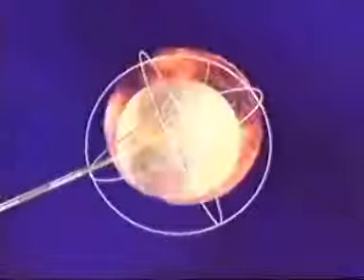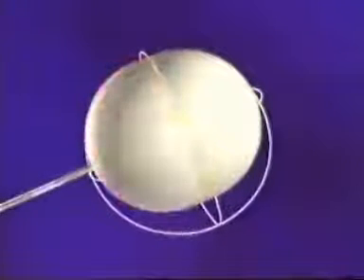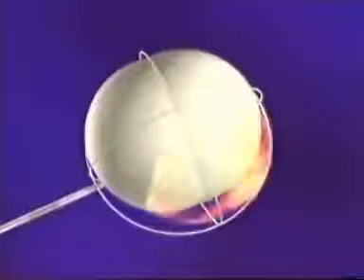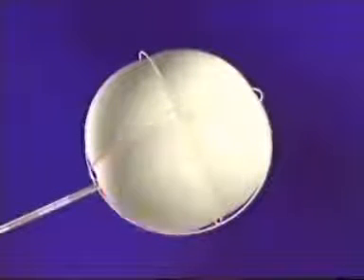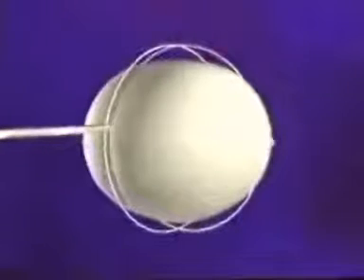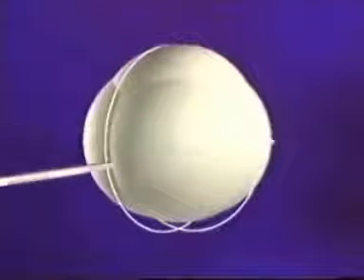To create an ablation 6 centimeters in diameter with the 5 centimeter device requires at least 6 overlapping ablations, as seen in this illustration. Depending on the shape of the lesion, usually some of the ablations can be done consecutively along the same track, requiring fewer puncture sites and needle placements.